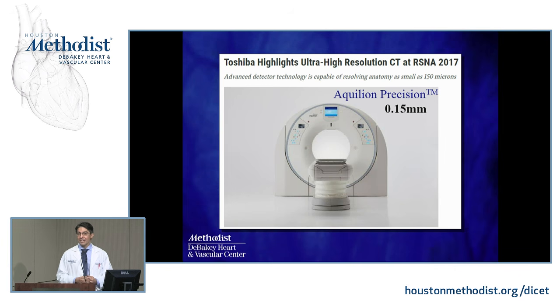So maybe invasive angiography may be, in the future, a thing of the past. Very important lesson. Okay, so I think we'll hear a lot about this, but this technique is out there and is a tremendous game changer, at least for imaging.